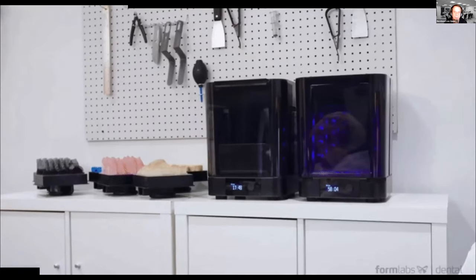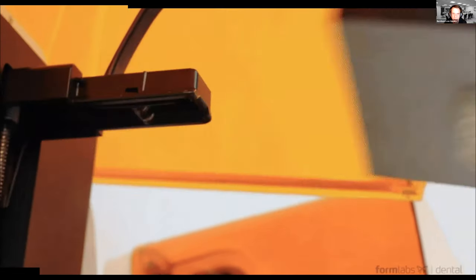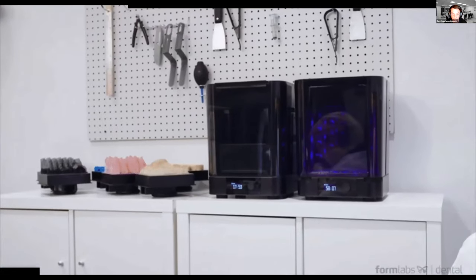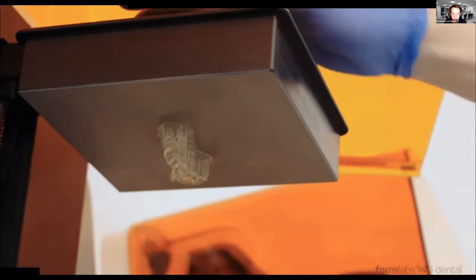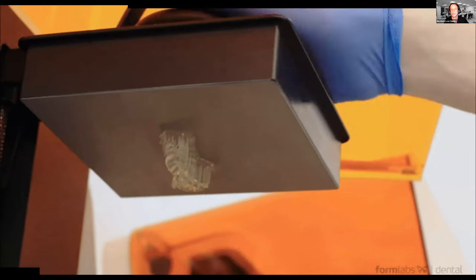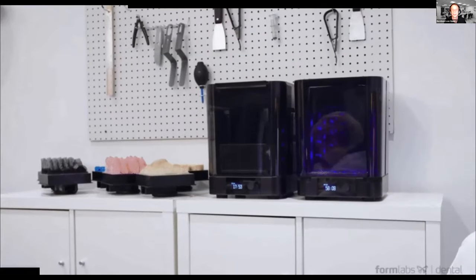So the first step would be you will have to bring the build plate to the Form Wash. The Form Wash is the device we have to remove the remaining uncured resin from the object. We use IPA to dissolve these resins, and the Form Wash automates this process a lot because you don't have to worry anymore about forgetting the parts in the IPA. You just set up your washing time for Gray and Dental Model. It will be like 10 minutes. After the wash cycle, the part will be automatically lifted up to prevent the part from dissolving in IPA.